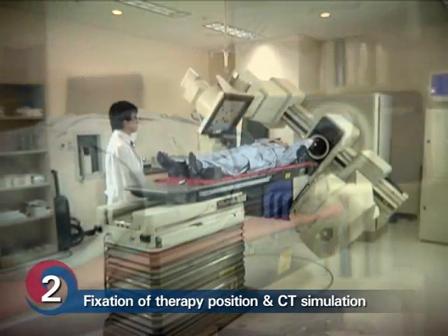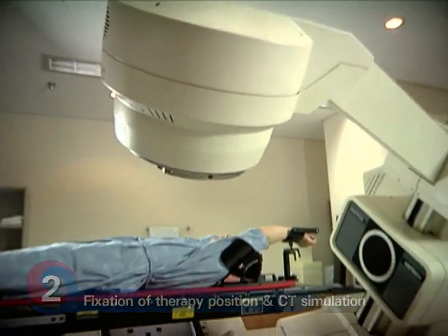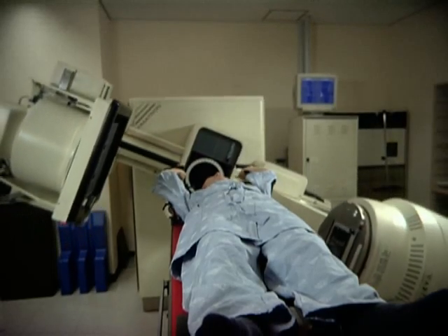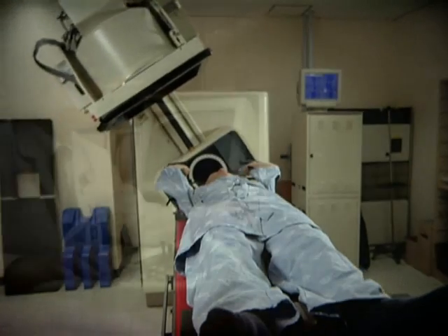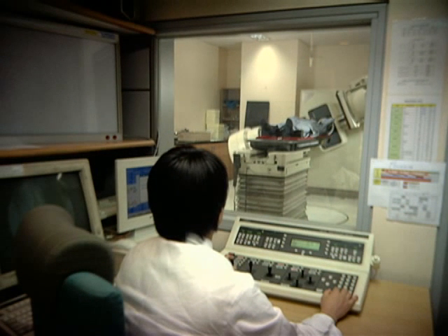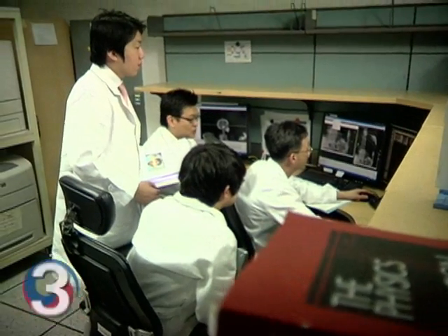This is the stage of radiotherapy planning. After deciding the treatment region and treatment position, the fixation instruments are manufactured. Then the treatment region is photographed and marked. The required time ranges from 30 minutes to one hour according to the patient's plan. Depending on the type of tumor, there are cases where simulation is done several times.